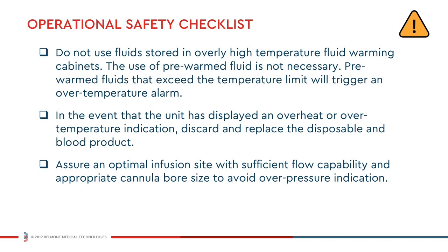Assure an optimal infusion site with sufficient flow capability and appropriate cannula bore size to avoid over pressure indication. Assure that bags have fluid in them.